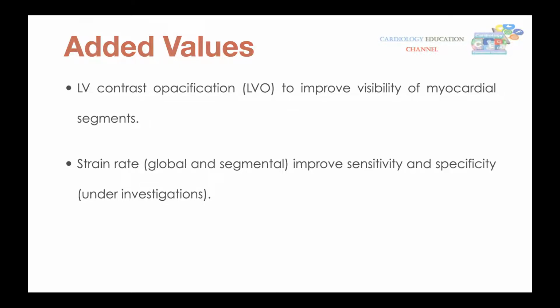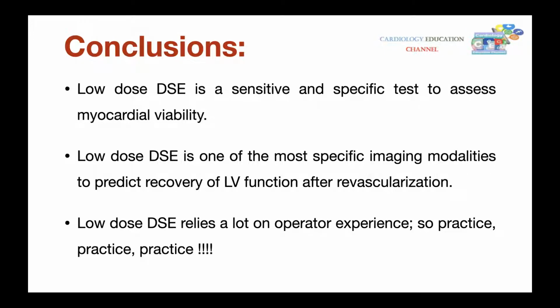So at the end, my conclusions are that low dose dobutamine stress echocardiography is a sensitive and specific test to assess myocardial viability. Low dose dobutamine stress echocardiography is one of the most specific imaging modalities to predict recovery of LV function after revascularization. And it relies a lot on operator experience. So practice, practice, practice, and train. And thank you for your time.